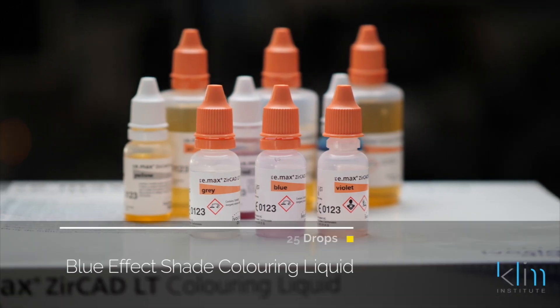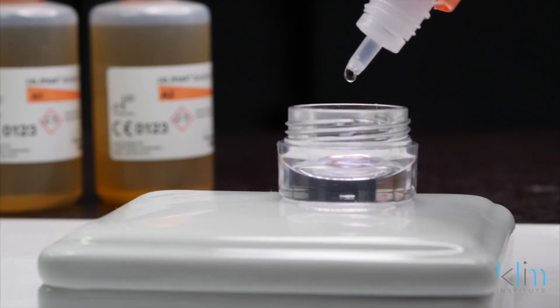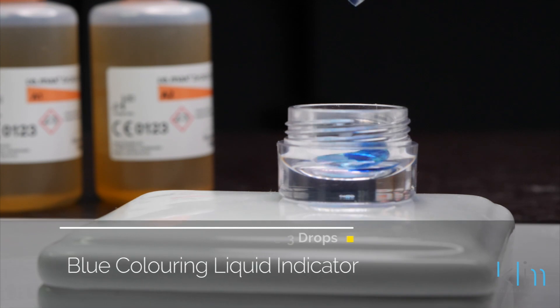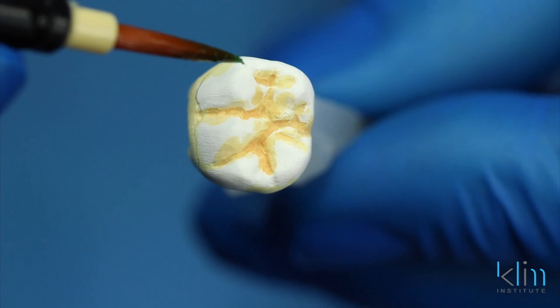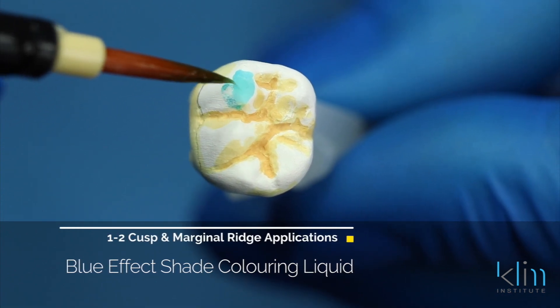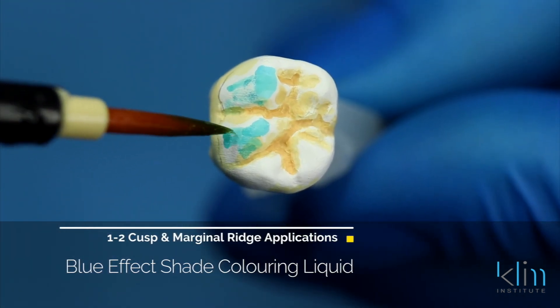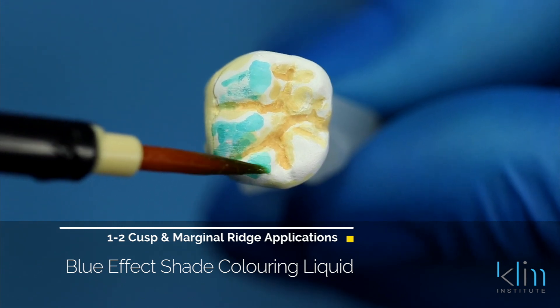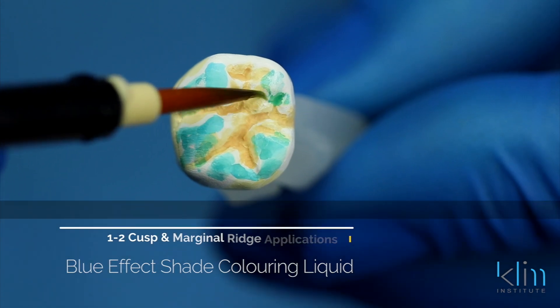The way I'm using the effect shades would be on the cusp one-half. My favorite shade is blue. For blue, we're going to put 25 drops of the blue coloring liquid in a jar, and then we'll place two to three drops of the blue dye. The blue color is my main color to bring down the value of the cusp tips. We'll apply one to two applications on the cusp tips and marginal ridges, and bring it down that triangular ridge to create a lower value and get the illusion of translucency.